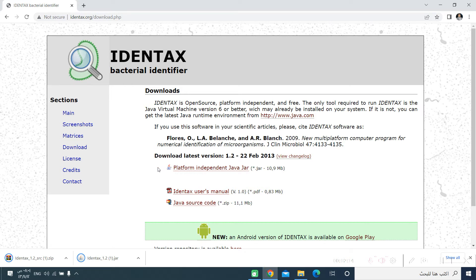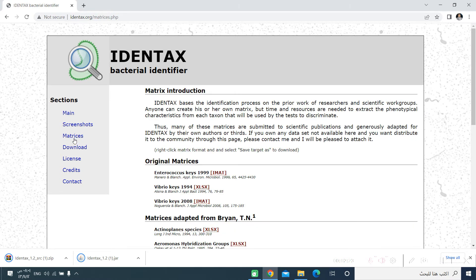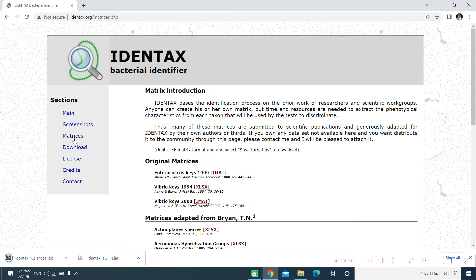Before going to the installation, we should have a look on the matrices. The matrices are either Excel sheets or in the IMAT format, which is the format of the IDENTEX software. It accepts both, but if the file is in Excel file, it should be converted or imported into the IMAT format. We will show you how to do it later on in this video.